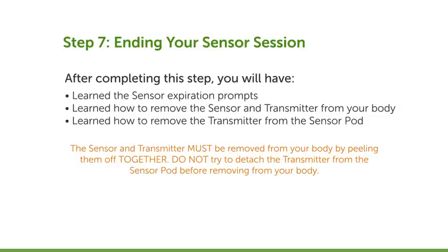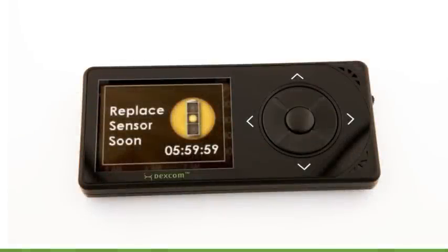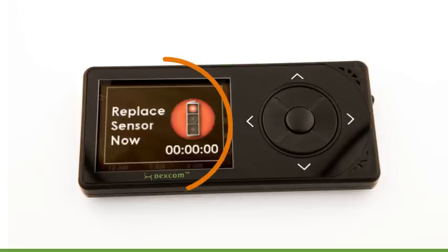At the end of your first sensor session, you may want to come back to this step of the tutorial and review it again before moving forward. The sensor automatically shuts off after 7 days, and the receiver will alert you before this happens.